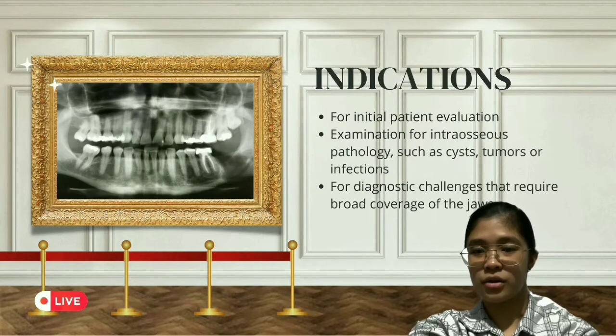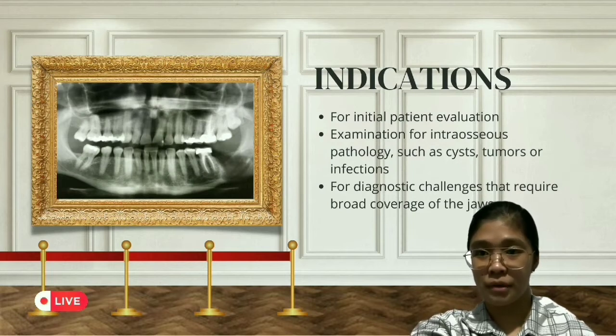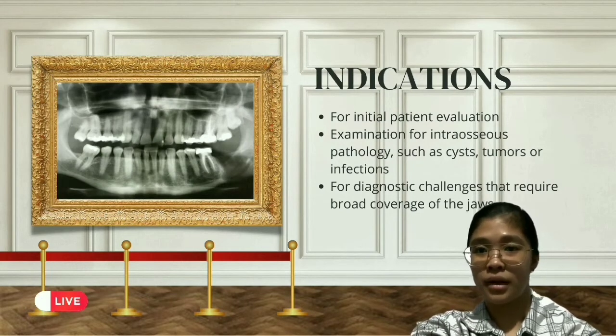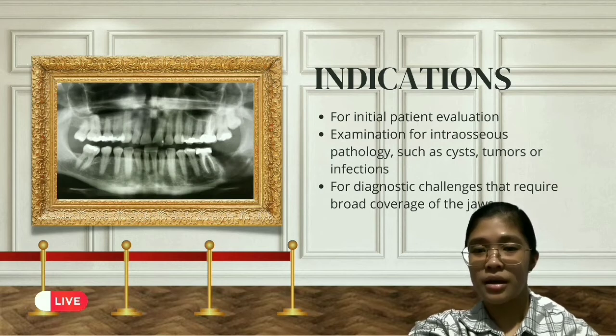It is also for determining the dental age estimation, and it is frequently indicated when professionals want to evaluate tooth developmental abnormalities, trauma, and to assist and assess orthodontic treatment.